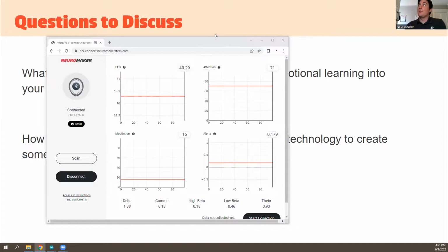One quick answer to that question: I know I have it on screen and I disconnected my headband, so it's not going to come through right now. But this headband is set up to measure the electrical activity coming from this part of the brain. On this raw EEG plot that we saw earlier, that gives you the waves. By using some fancy math over that, called a Fourier transformation, you can see what these different waves are at any point in time.